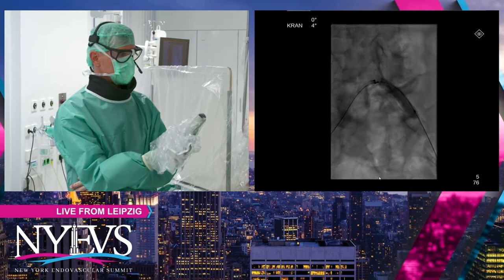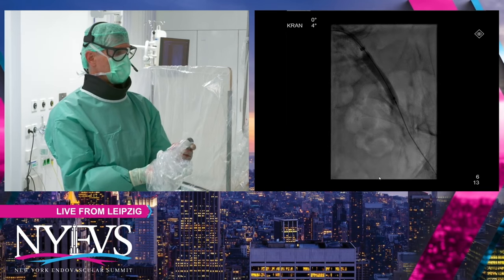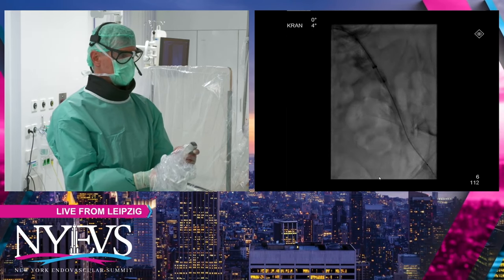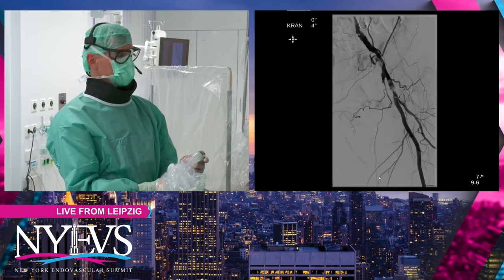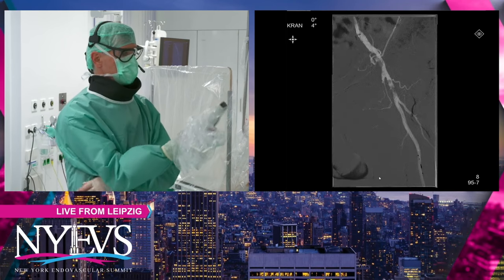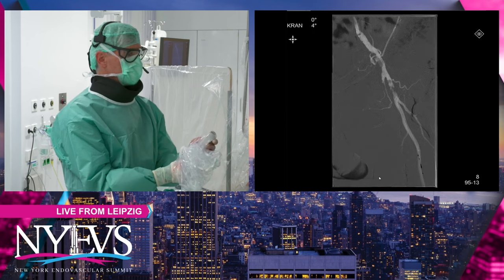So we used a 7 by 40 millimeter balloon to get the 8 French sheath crossover, otherwise there is a risk of damaging the stent and it would not have been possible to go crossover. That's where we are, and we loaded a filter now, a bigger filter, in the profunda artery, which we opened.